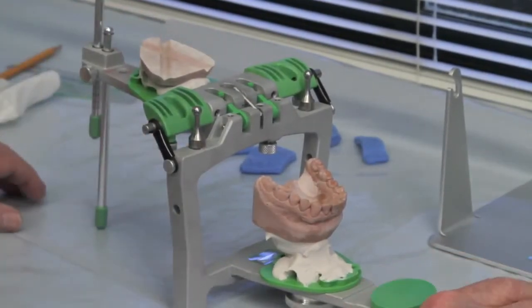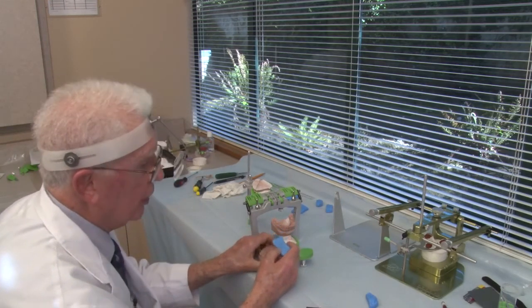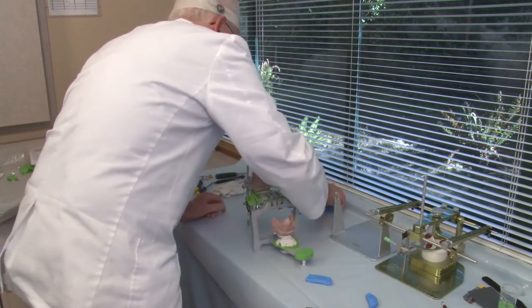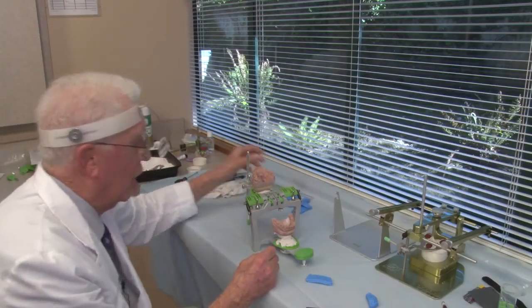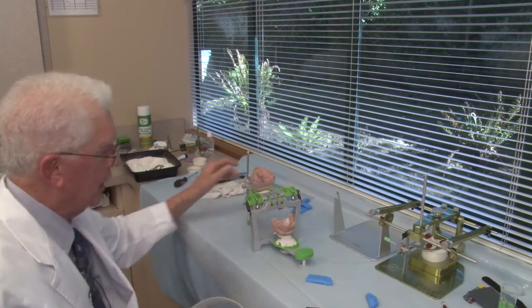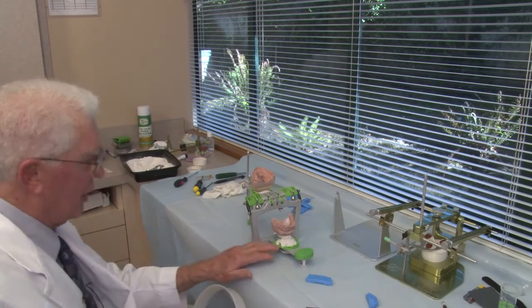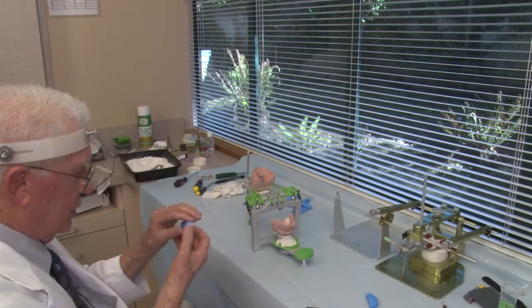Now I have another power-centric bite that I did, but in looking at the wax bite, I don't like the shape because in trying to locate exactly how to put it on the upper posterior teeth, it was difficult to figure out exactly where it goes. But let's check it and see if it split cast checks. I do know though that the first power-centric bites that I use to mount these models, I will mount all the other models in this case using those wax bites, because I have verified the accuracy of those wax bites by using different thicknesses of wax and split cast checking this mounting. They all three thicknesses, varying thicknesses, split cast check, so I know it's an accurate mounting for this patient. So all the other models I have for this patient will be mounted using that first set of power-centric bites. But let's see if this one will check.